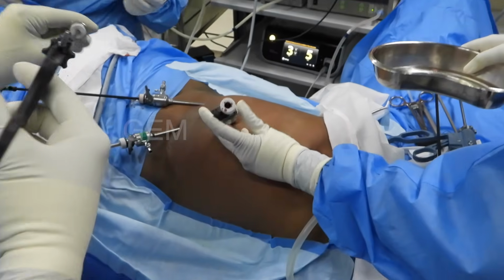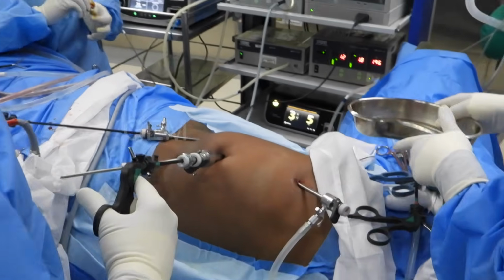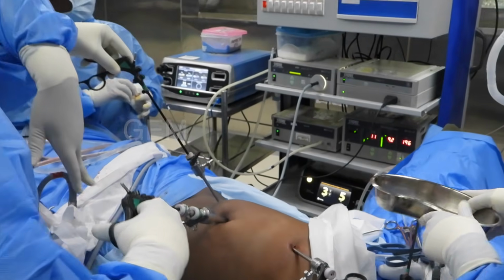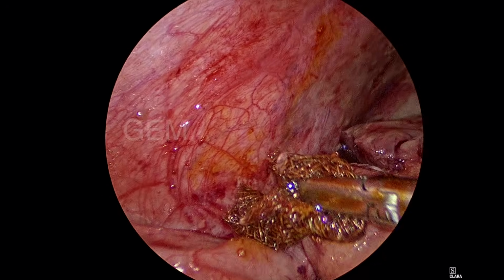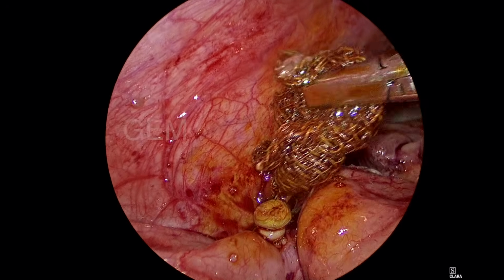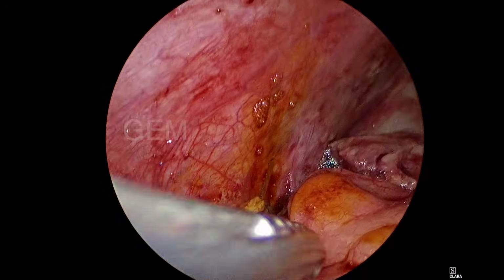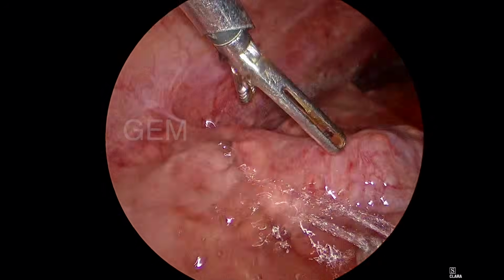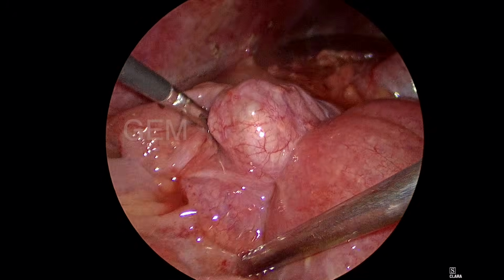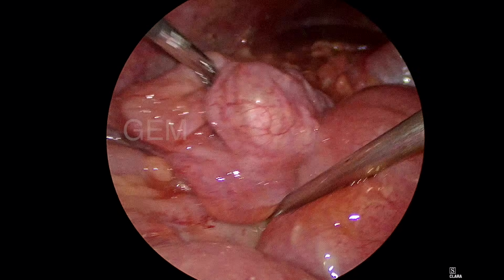And always the stump will be sterilized with betadine. The exposed mucosa of the appendix I am sterilizing with a betadine gauze piece. In the late 90s and early 2000s, we used to apply cautery to the mucosa to sterilize it. That cautery would spread to the base of the cecum. That's why nowadays we are not doing it.